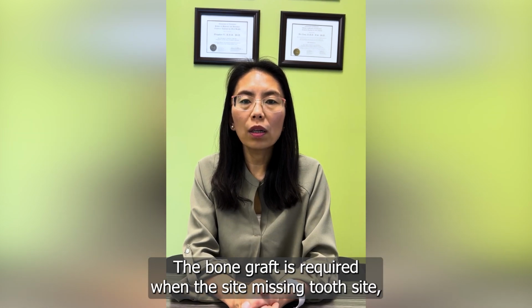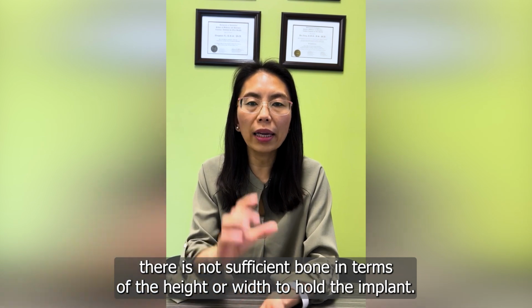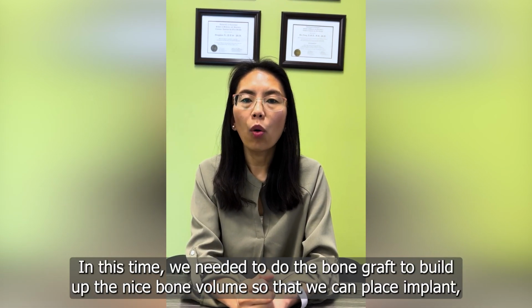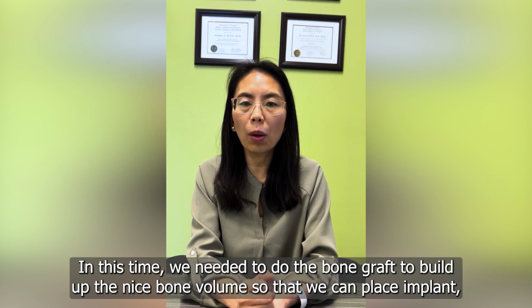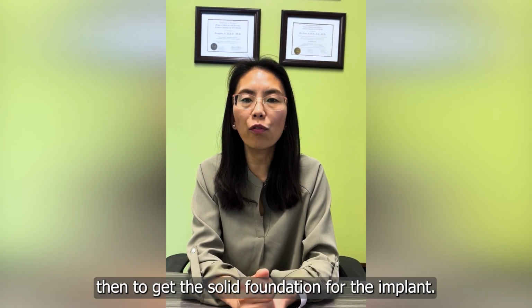The bone graft is required when, at the missing tooth site, there is not sufficient bone in terms of height or width to hold the implant. In this case, we need to do the bone graft to build up a good bone volume so that we can place the implant and get a solid foundation for it.